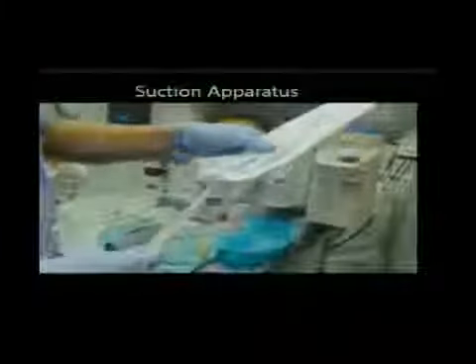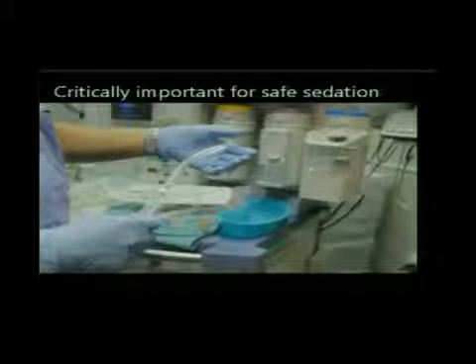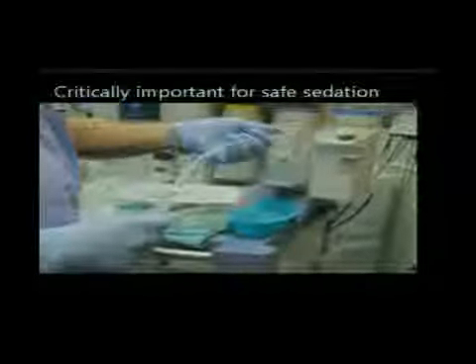So you check the suction apparatus. You have to know that it works. So here he takes the suction apparatus. This is absolutely critically important for safe sedation. You'll see him now put his hand over it, continue, and he checks that he can feel the suction coming through that. And then he looks down at the control device here and verifies that it can actually create suction.